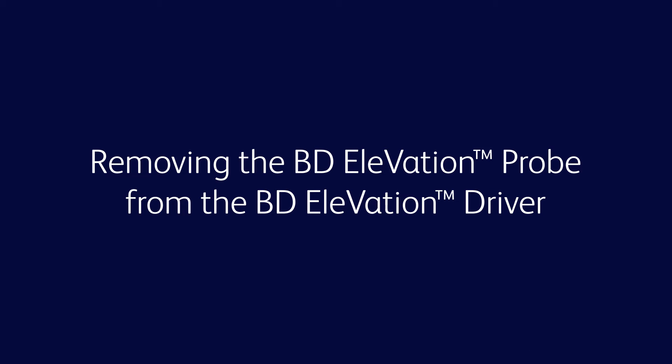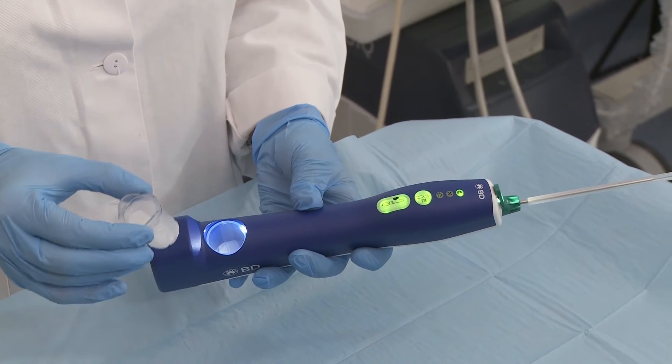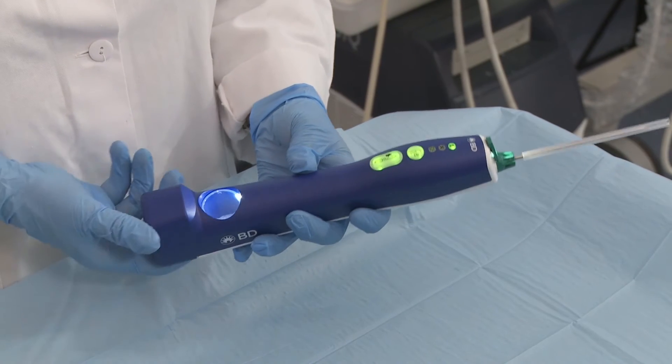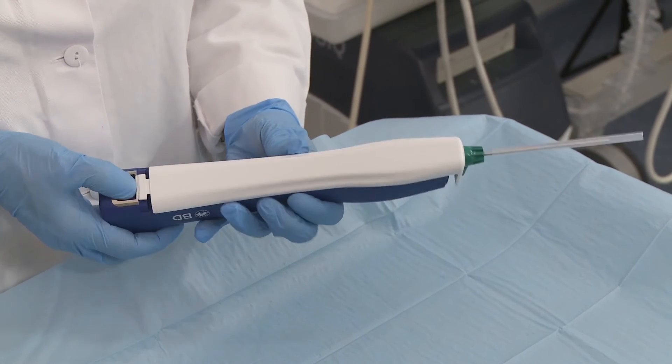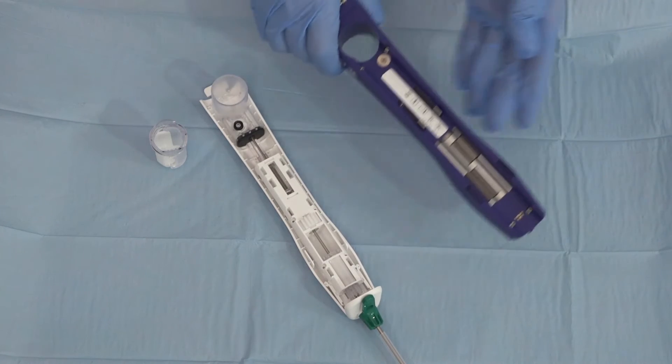The sample container may be removed before or after the BD Elevation probe is removed from the driver. Option 1: Turn the sample container counterclockwise to remove it from the driver. Then remove the probe from the driver by pressing down on the locking tab, sliding the probe cover completely forward, then pulling the probe straight up from the driver.